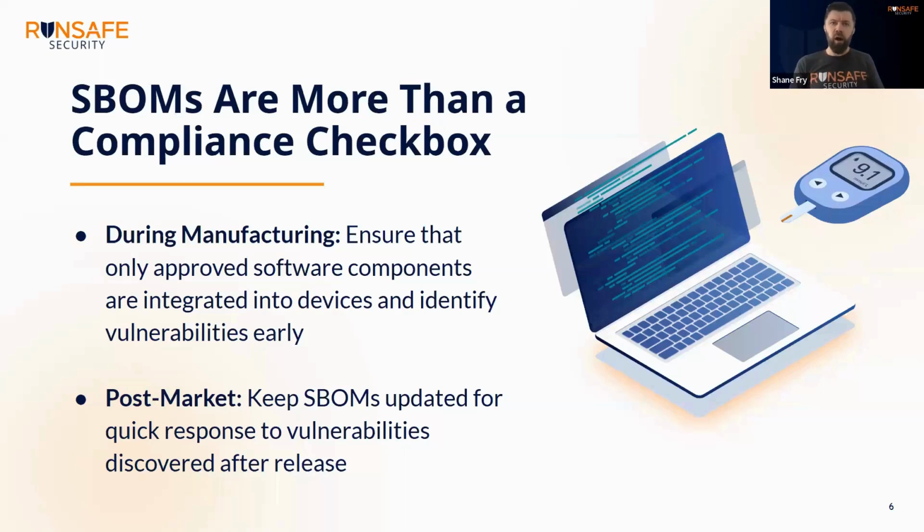And for a while, SBOMs are relatively new, but we've had this concept with software composition analysis tools in the past. And then we've seen, all right, you must do SBOM, lots of executive orders and regulations coming across the world for you must do SBOMs, but not going far enough to say you've got to act on them. Right. So cool, I can build a list and the list can be accurate, but we need to analyze that list, and that's where we want to talk about SBOMs as more than just a compliance checkbox.